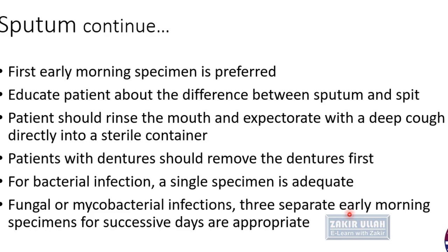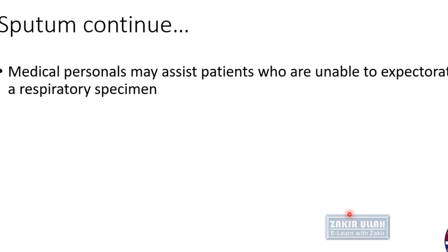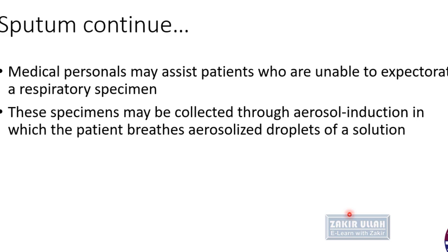So this is the standard procedure for the examination of sputum for fungal or mycobacterial infections. The healthcare professional or medical personnel can assist patients who are unable to expectorate a respiratory specimen, and these specimens may be collected through aerosol induction.